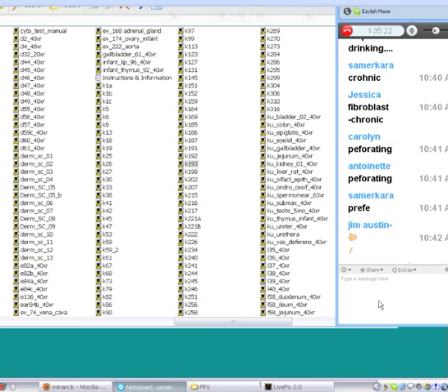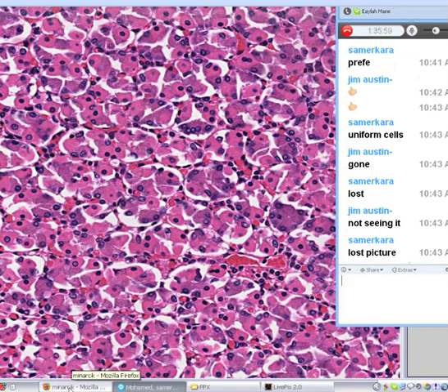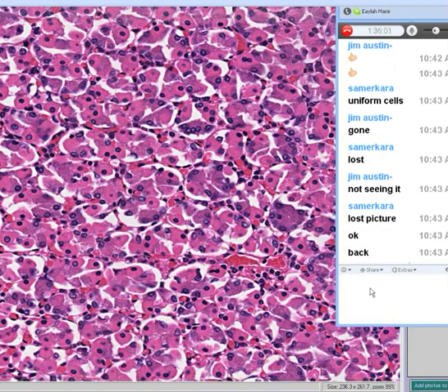So you know this is stomach because all of those nice bright orange cells are parietal cells, aren't they? And the darker ones are chief cells. So look, you see where my little pointer is? These are chief cells over here. But most of these little cells with the central nucleus and tremendously orange cytoplasm, these are parietal cells.